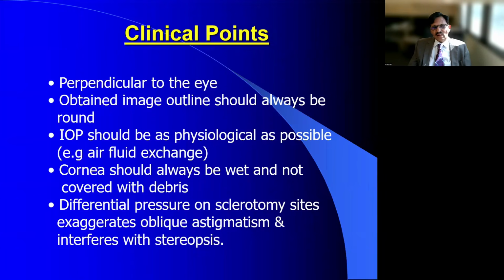Another thing that is commonly not looked into is that intraocular pressure should always be in the physiological range. If it is high, then you will have corneal edema that will mess up your image very fast.